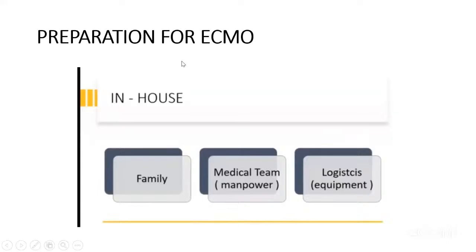So in today's lecture we come to the preparation for ECMO. Preparation for ECMO can be challenging as the patients are critical. They are on multiple life supports. They may require high ventilator support. They might be on high vasopressor support. They might have multiple other comorbidities which make them critical, and initiating ECMO support becomes more challenging.